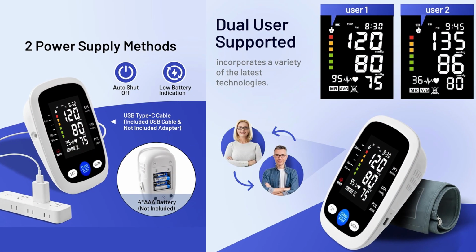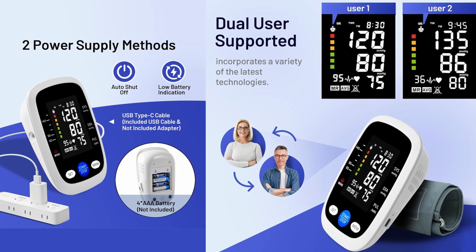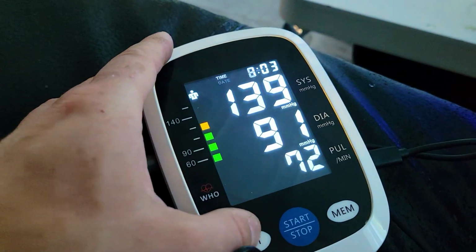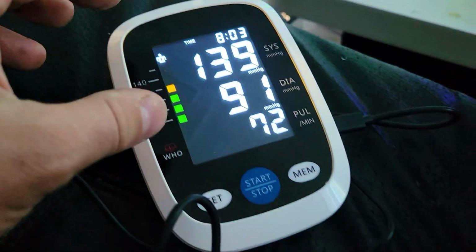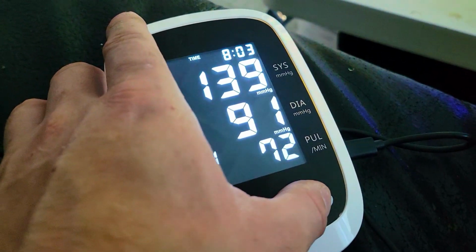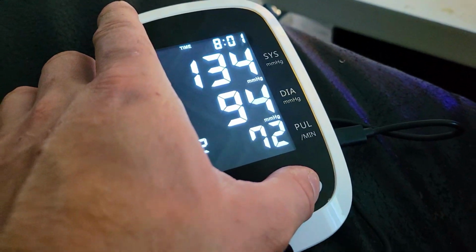You see, that's a 1. To change the date, you click set. Then you can change the date. Same with time. You can change the date or the time. Mem pulls up the last few measurements that you've done.